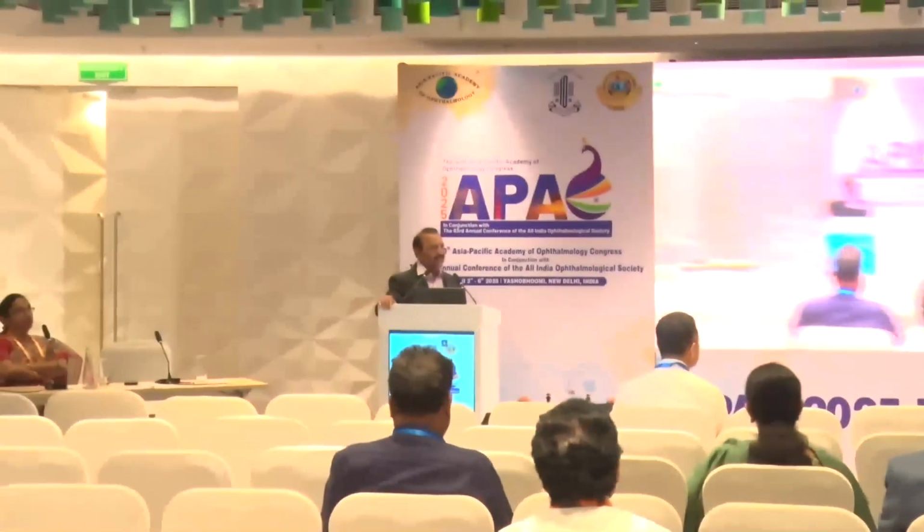Sir, how much change in the macular program, how much change in the decibels do you think is suggestive of progression? Like the patient has done one macular program in the previous visit. No, actually, I told you, what is the residual field the patient is having.